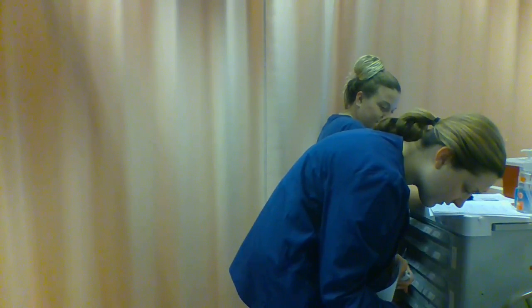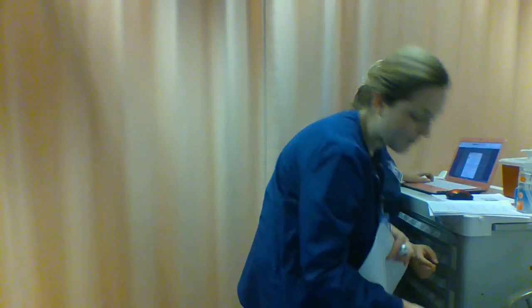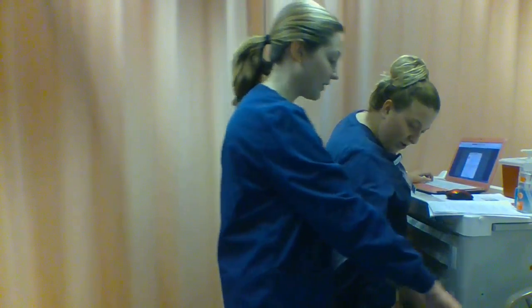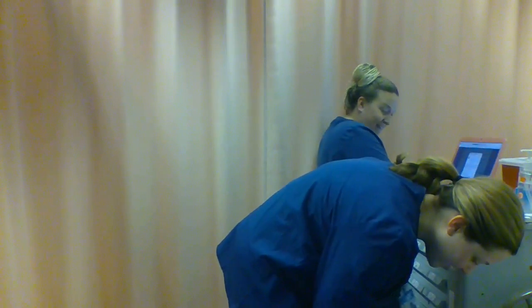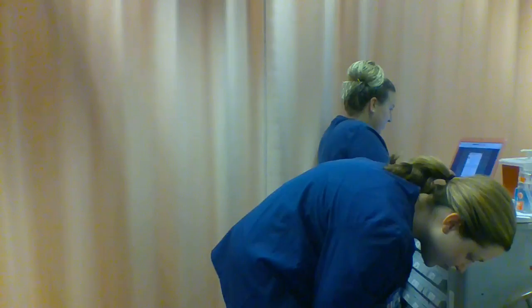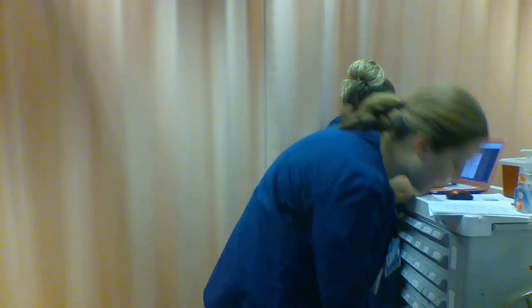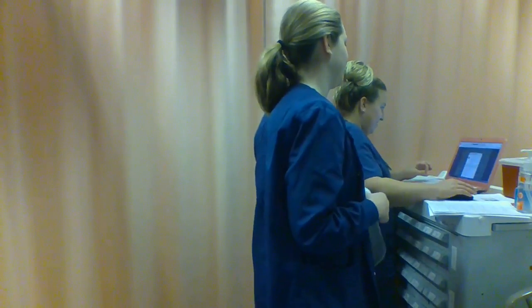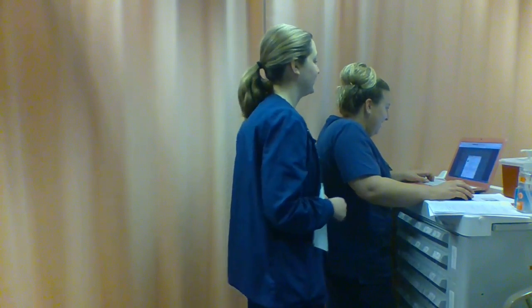Is it this number? It's not the mouth worker number. It's this number over here. Yeah, the barcode. That's what, because we've been using this number the whole time. All right. Well, can you read me that one? Okay. Sorry about that. 650-255-5339. All right. And we're getting the Green light.